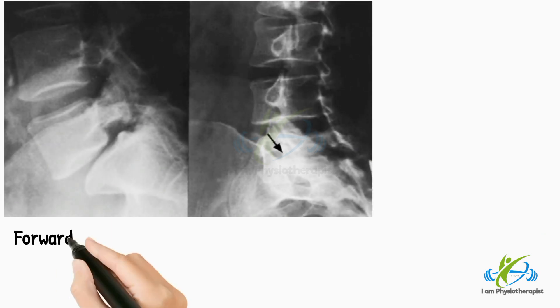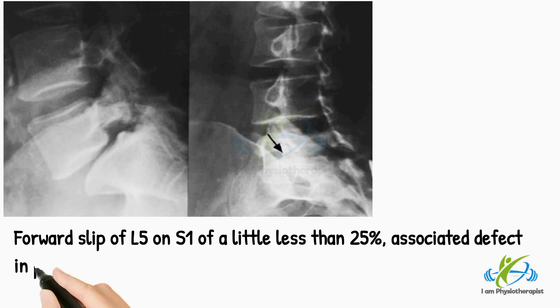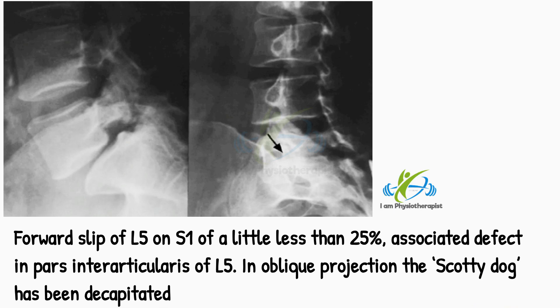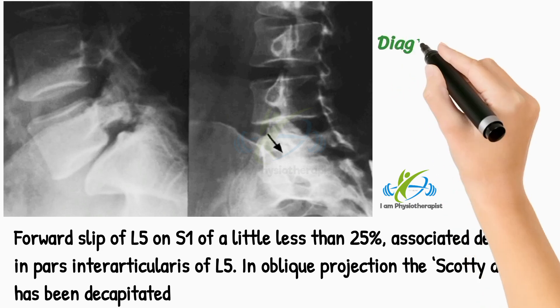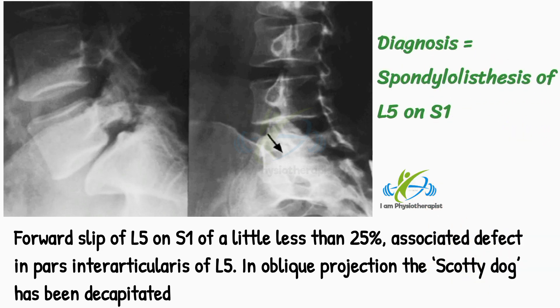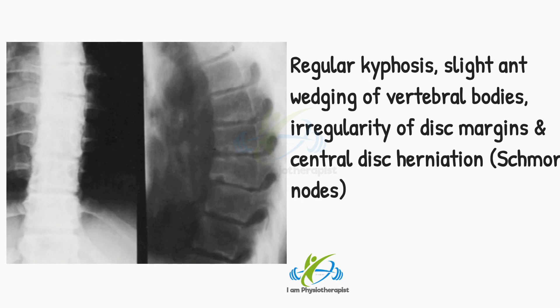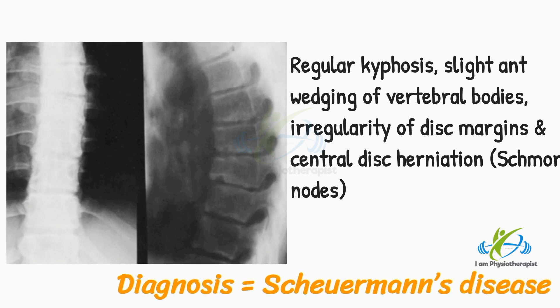This lateral radiograph shows forward slip of L5 on S1 of a little less than 25%, with an associated defect in the pars interarticularis of L5. In the oblique projection, the 'Scotty dog' has been decapitated. The patient complained of low back and buttock pain. Diagnosis is long-standing spondylolisthesis of L5 on S1. In this radiograph, there is a regular kyphosis with slight anterior wedging of the vertebral bodies, irregularity of the disc margins, and central disc herniation — Schmorl's nodes. Diagnosis: the appearances are typical of Scheuermann's disease.